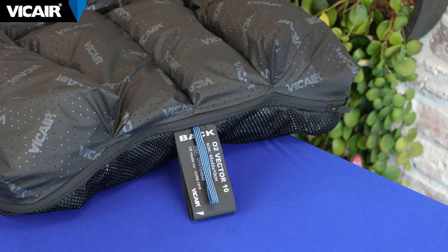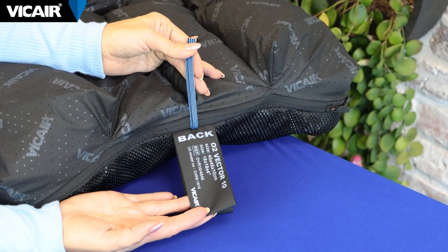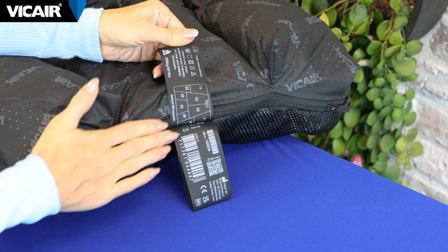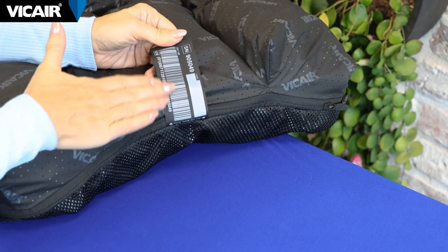At the back, we have the label of the cushion that provides all the information you need: the cushion size, the weight capacity, article code, the filling grade, the serial number, and the washing instructions.